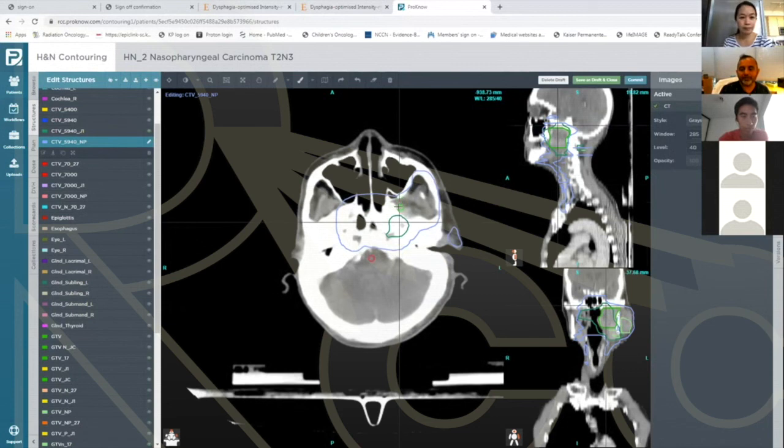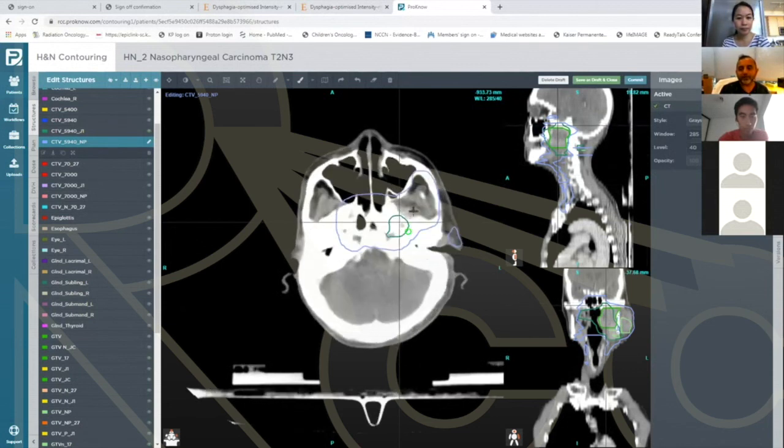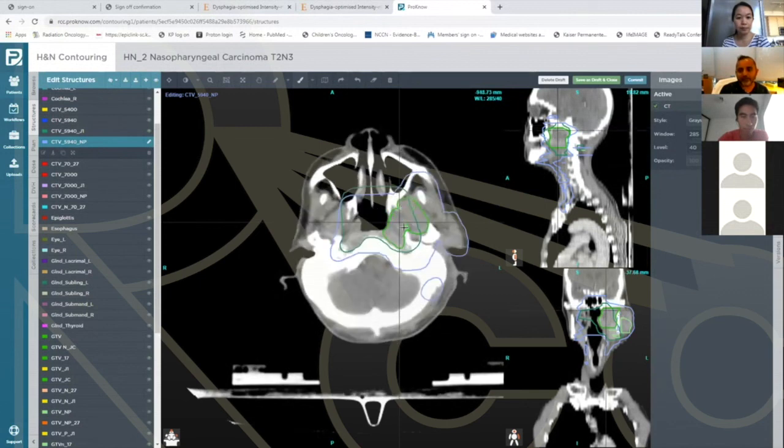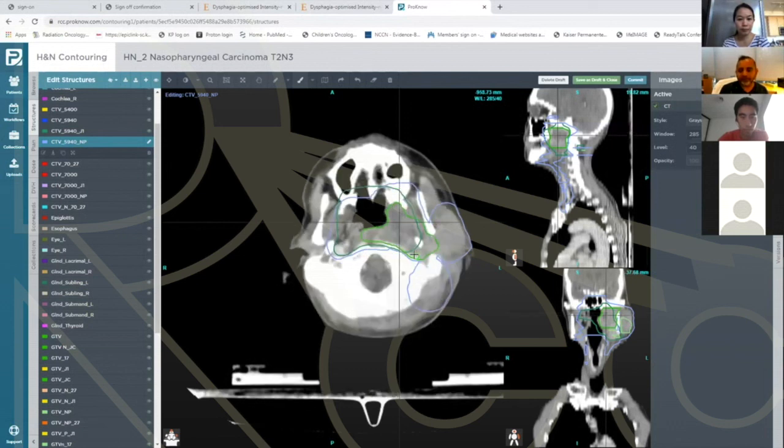But you can see nowhere will you find that you have to treat all of this. But this is a case where you have to treat the infratemporal fossa because of this tumor growing right out through here. You can't see the planes very well. There's a nice and healthy fat plane here between the torus and the musculature. There's just no plane here. And then when you come down here, you can see this very necrotic tumor that truly is going past the lateral pterygoid musculature here. So definitely a very bulky tumor.